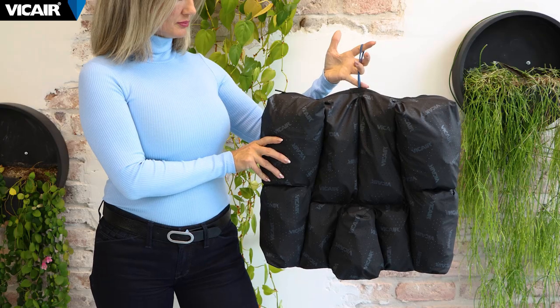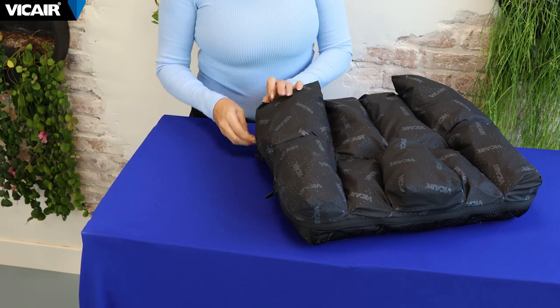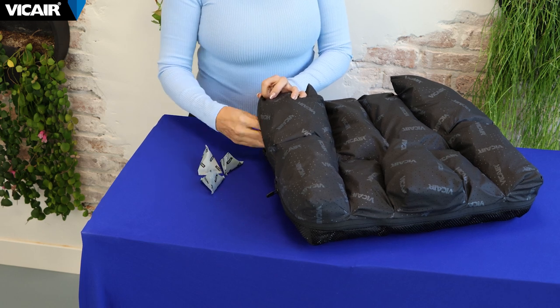Do not use any cushion if bottoming out occurs. With vCare cushions, bottoming out can be easily corrected by simply adjusting the filling grade of each compartment.